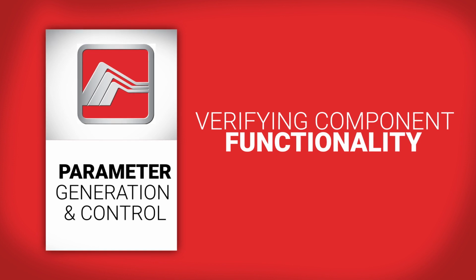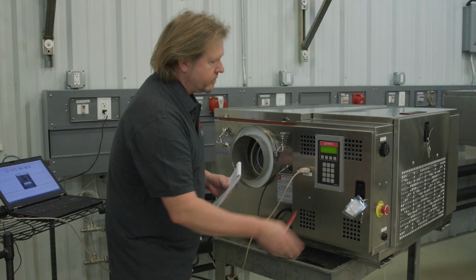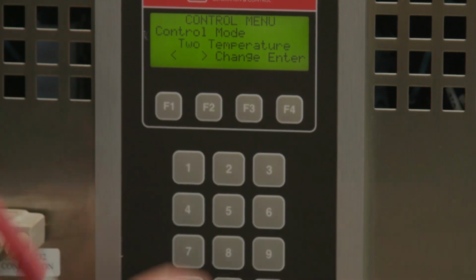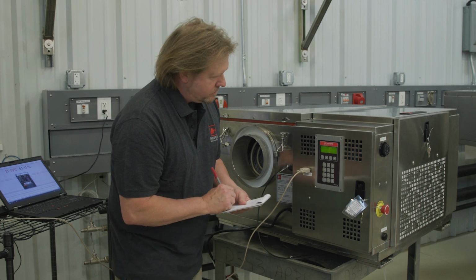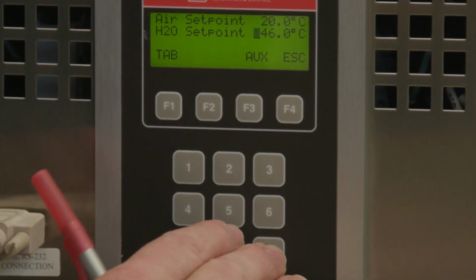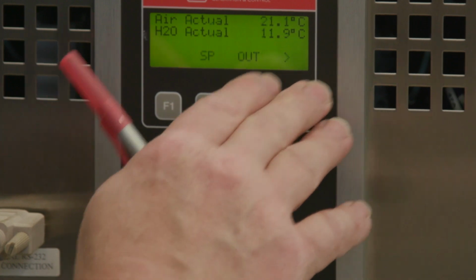We'll now go into a more in-depth look at verifying component functionality for maximum heating. Start by documenting the SmartPad control mode. Configure the SmartPad for 2-temperature control mode. Adjust the water set point in order to provide 100% water heater output. Adjust the air set point in order to provide 100% air heater output.